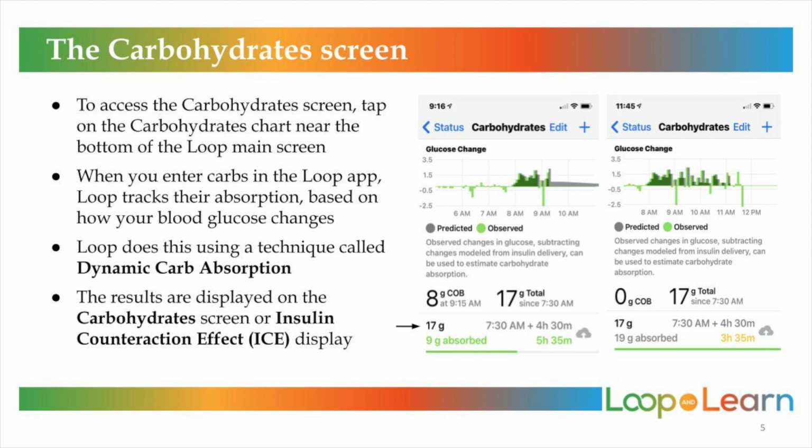This is the carbohydrate screen. You may see it sometimes referred to as the ice screen. This screen is full of information for a looper that I'll go over. Basically, when you enter carbs into Loop, Loop is using something called a dynamic carb absorption model that tracks the absorption of carbs based on the observed glucose change. When you make a food entry, Loop will save it to the top line seen here at the arrow. Loop will start tracking the entry, but as it does, Loop is assuming you might have been wrong in your entry and that the food might take longer to absorb than the time you entered. You can watch the meal absorb on the screen.